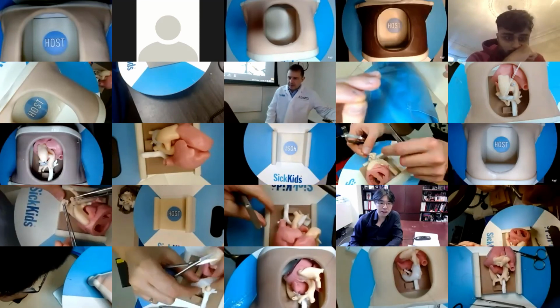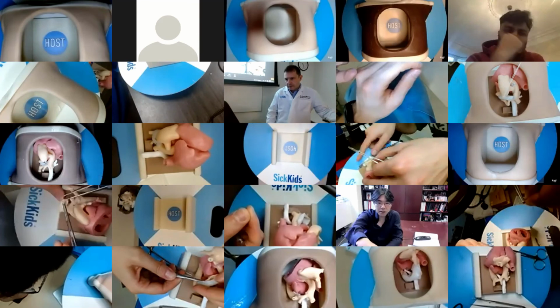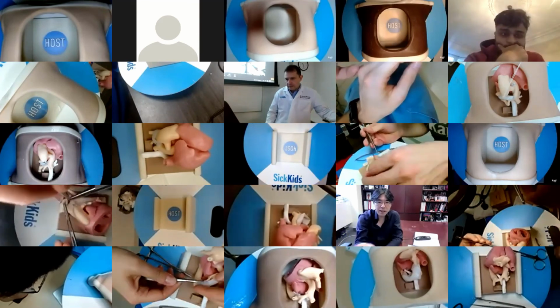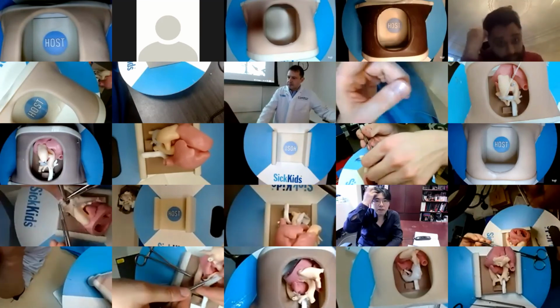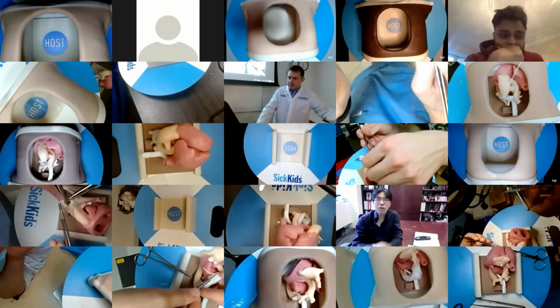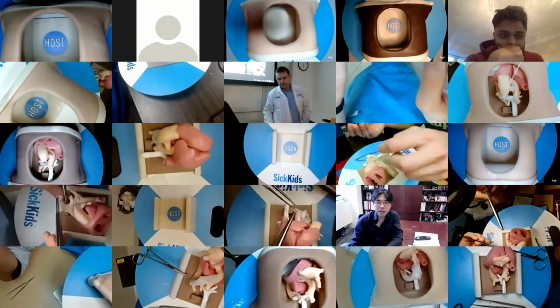I just make the first part of the patch and then trim as we go. Once you know where to trim the patch, it shouldn't be too complicated, hopefully.